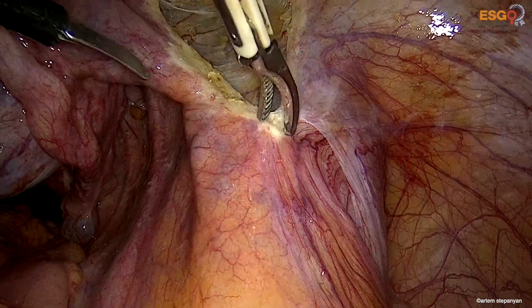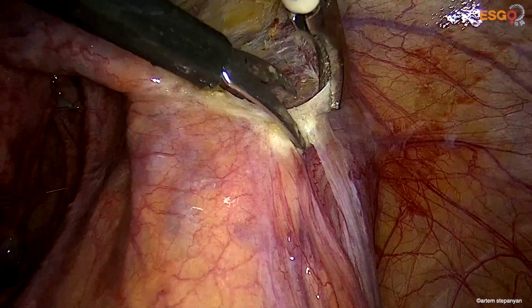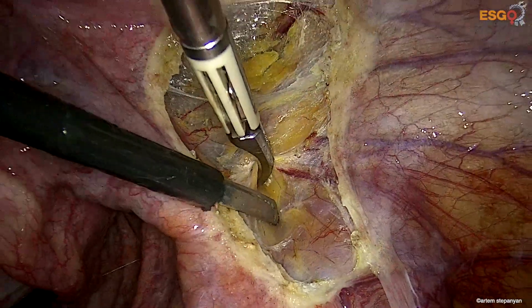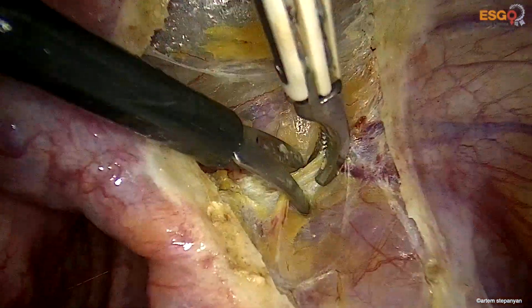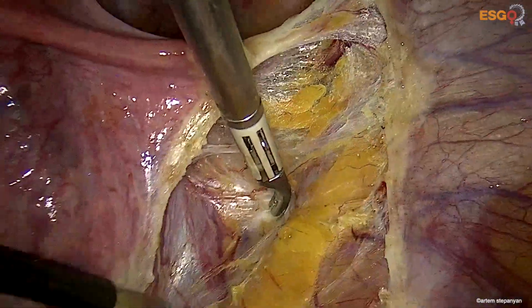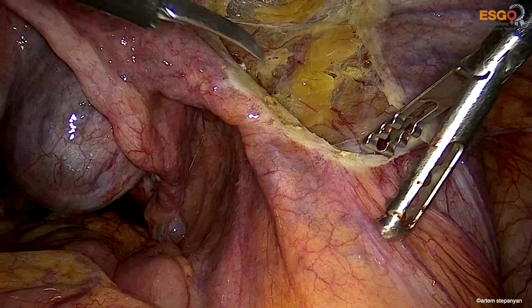The proper traction and counter-traction of the structures to be coagulated and cut gives us good enough precision and bloodless dissection.